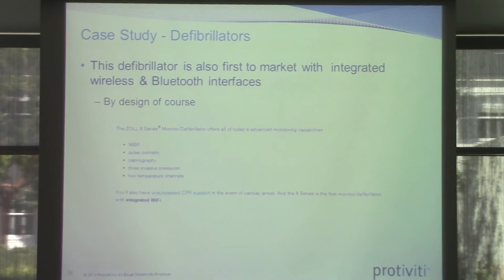It was also the first defibrillator to market that had integrated wireless and Bluetooth, and there are some screen caps from their marketing about how it's the greatest, on their website and in their literature. And of course, that's by design. Understand there's a clinical reason why all of these security flaws are there, or this attack surface with all this wireless and cellular connectivity. Why would you want an external defibrillator to have cellular connectivity?